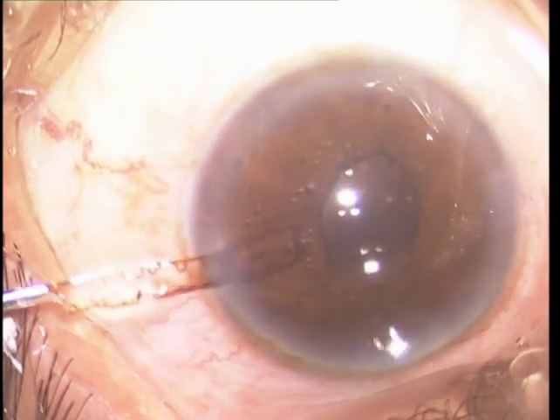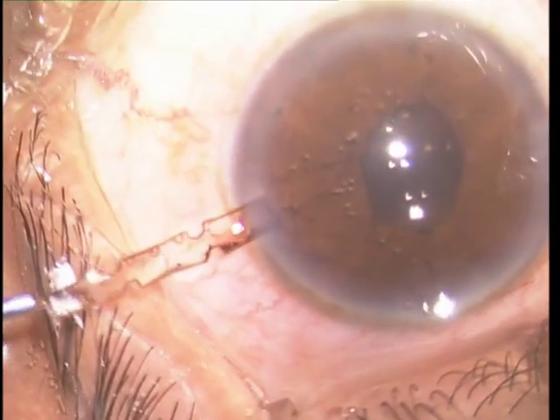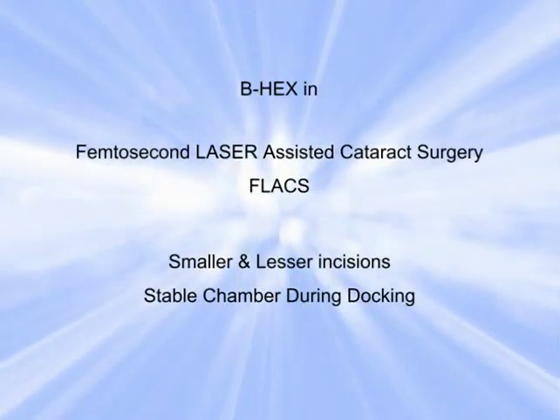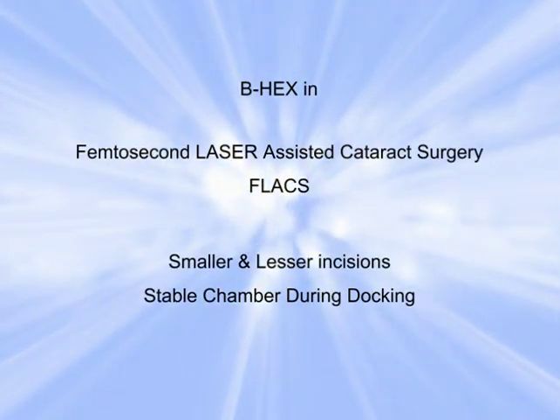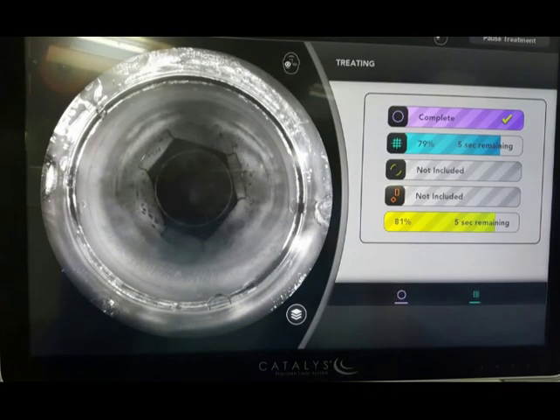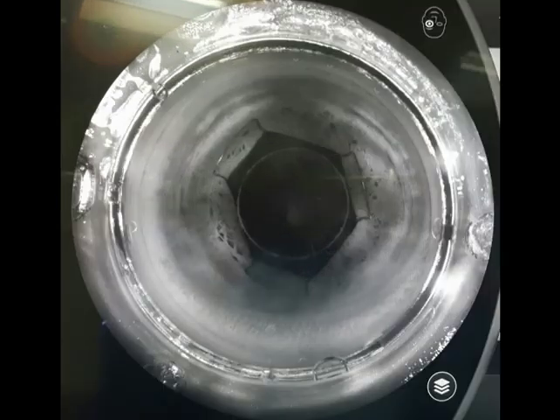We have a wonderful round pupil at the end of surgery. This is an advantage in femtosecond laser-assisted cataract surgery, where it helps maintain a well-formed anterior chamber during docking.